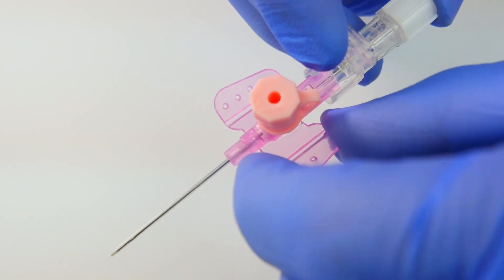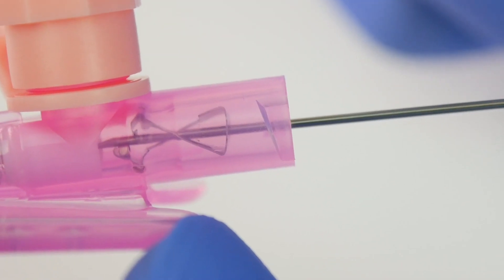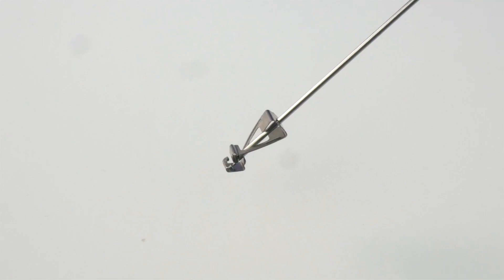The last part of the cannula we need to mention is the needle safety cover, which as we remove the needle, becomes detached from the device to securely cover the needle, thus preventing any needle stick injuries from occurring before we can discard it into the sharps bin.